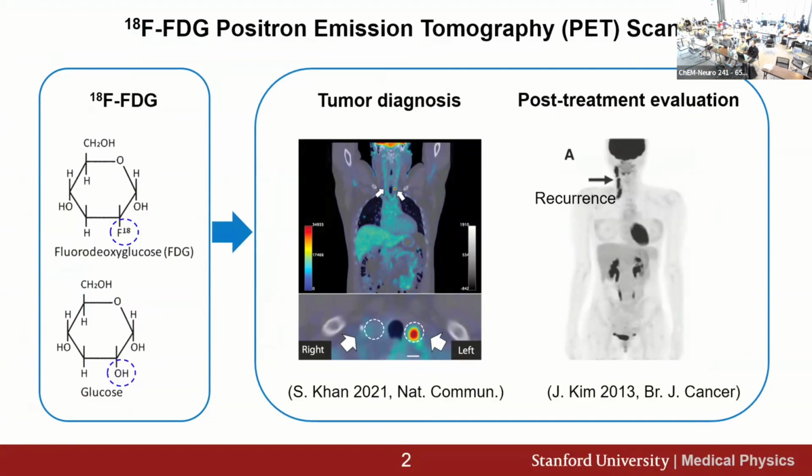Then typically clinicians will just use the two-compartment model. But recently we found the physiological environment and the vessel structure will also affect the pixel intensity that we observe in medical images. So now we encode those criteria in this tool.